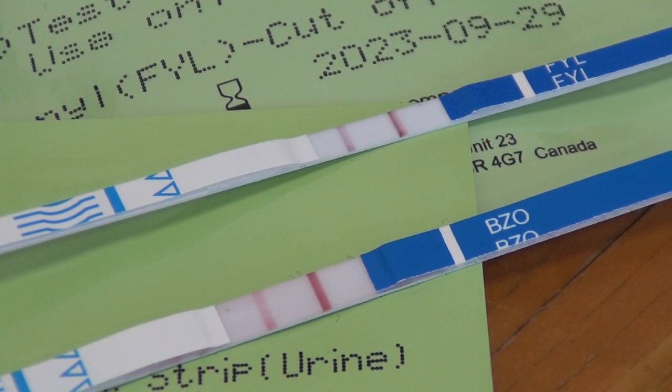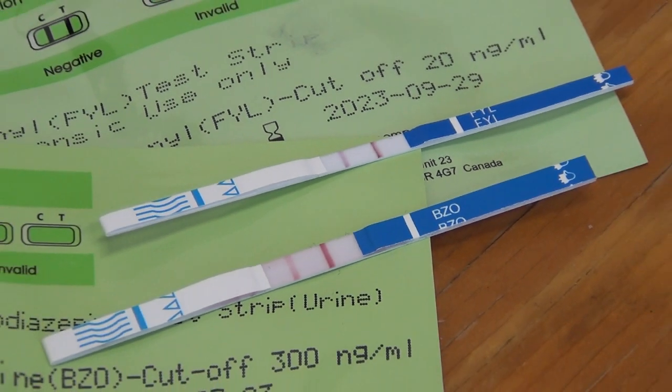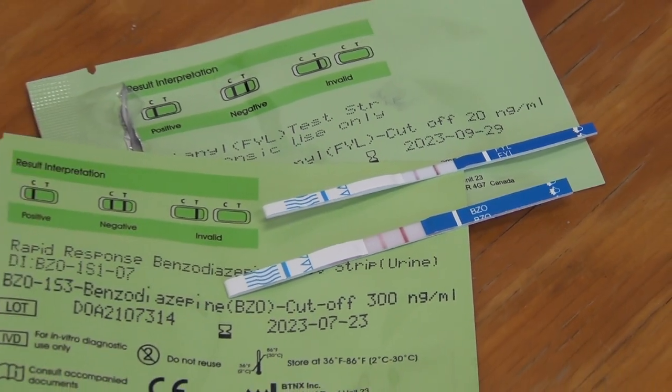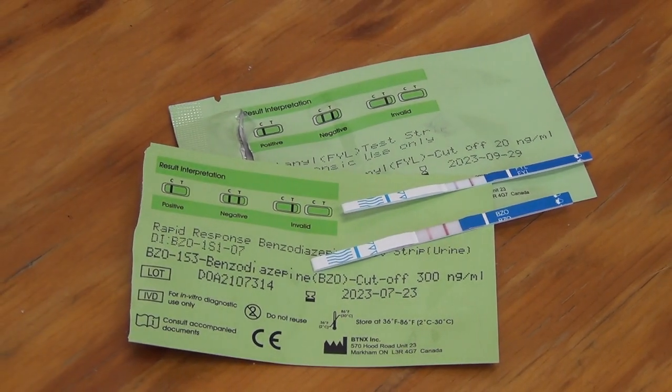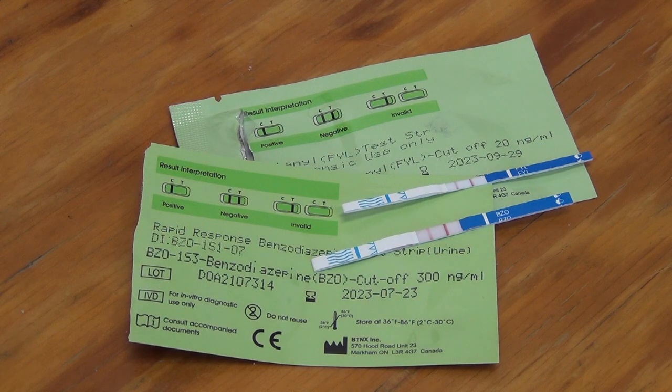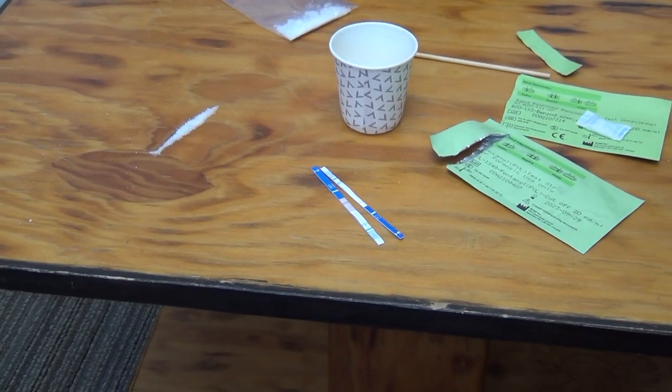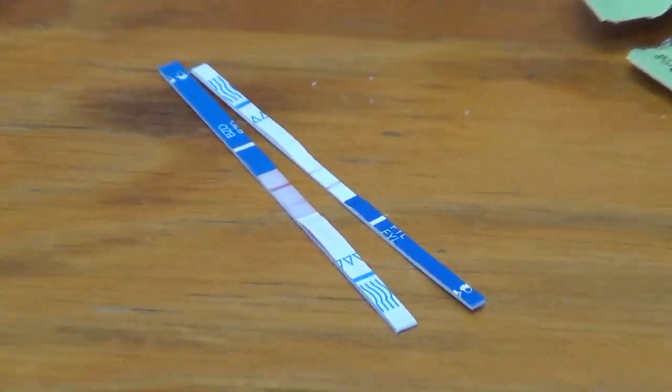These kits only test for the one substance written on the back. If you receive a negative result for fentanyl, there is no guarantee there isn't something else such as benzodiazepines in the supply you tested from. Keep this in mind and test for each substance that you are worried could be present.